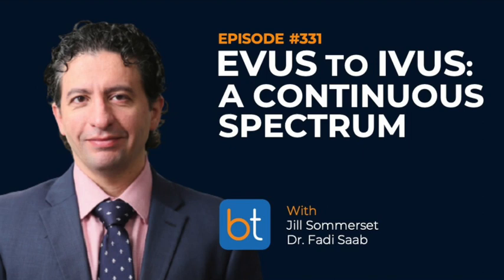Yeah. In most cases, just having at least one linear probe will get you most of what you can see, right? Any tips and tricks on what to look for when you're investing in a high-end system? Yeah, I think a linear probe and certainly a high frequency. We use a hockey stick probe for pedal access. Okay, perfect. Is there anything else that you'd like the audience to know about how you use EVUS and IVUS in your lab every day to take care of patients?